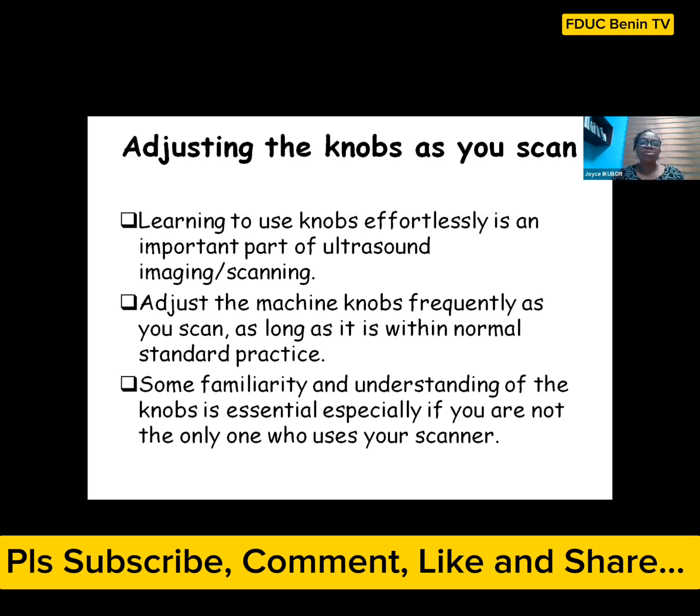And one of the things you will learn is that you have to adjust your knobs as you scan. It's abnormal to scan a patient from the beginning to the end and not adjust any of the knobs. No, it's not normal standard practice. As you scan, you find yourself adjusting the knobs to suit you, to be able to obtain the optimal image. So getting yourself very familiar with these knobs, understanding these knobs, is very, very important.